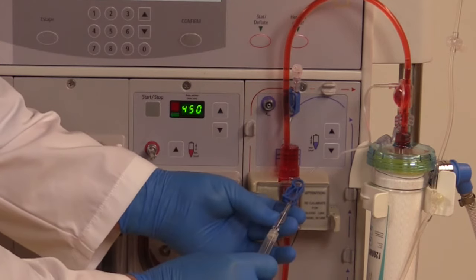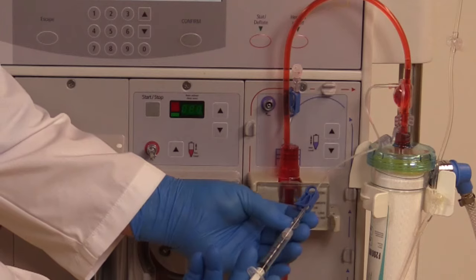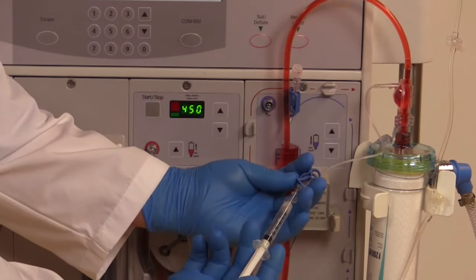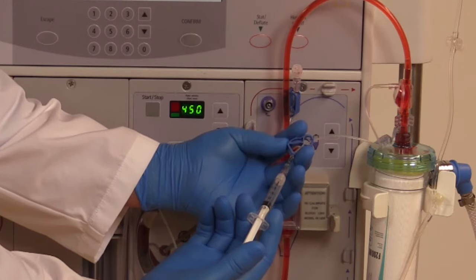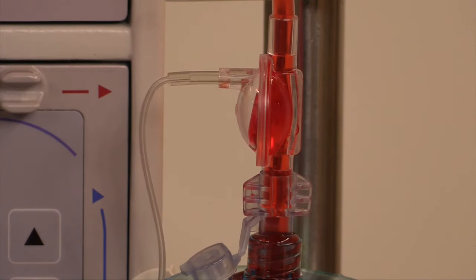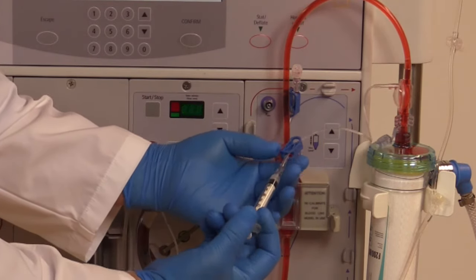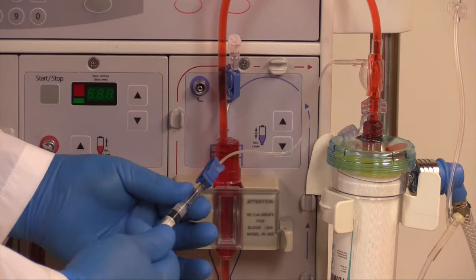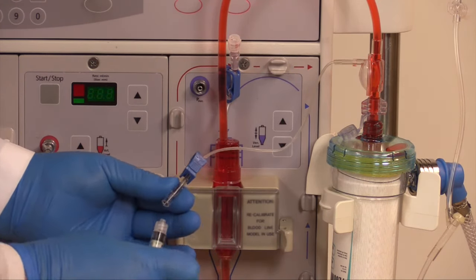Attach a sterile syringe with 3 mL of air to the monitor line. Open the monitor line clamp. Inject the air, moving the diaphragm to the back wall of the pod. Close the monitor line clamp. Reattach the monitor line to the venous pressure port.